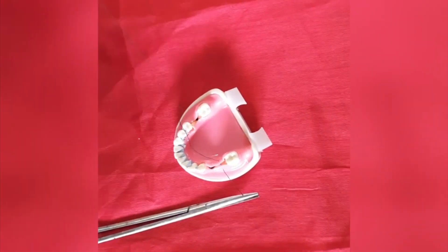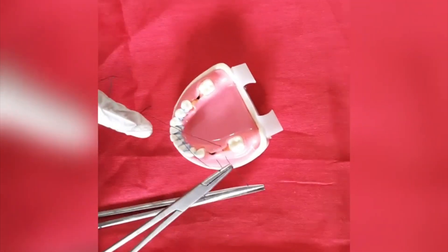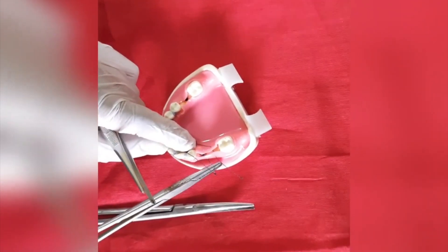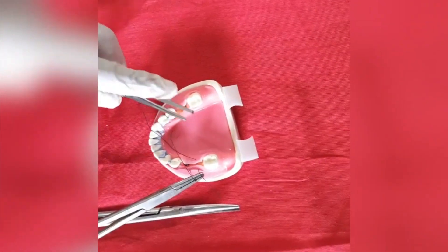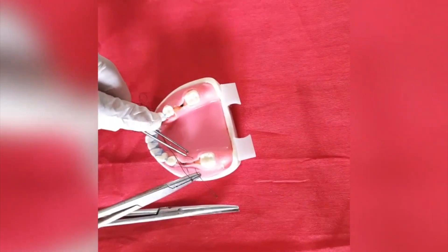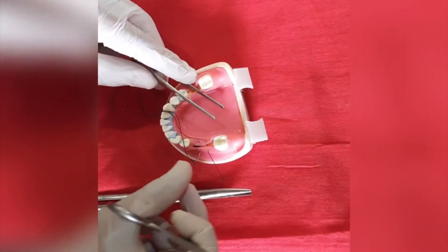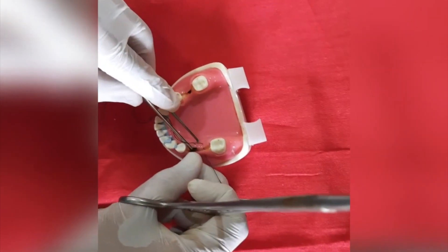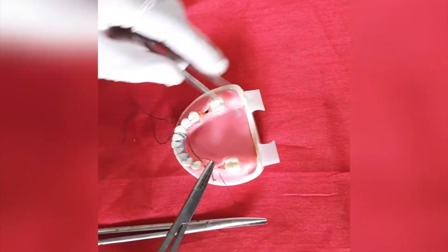Then again grab the needle and enter it from the same side you entered the first time. Remove it from the other side and grab the thread end.